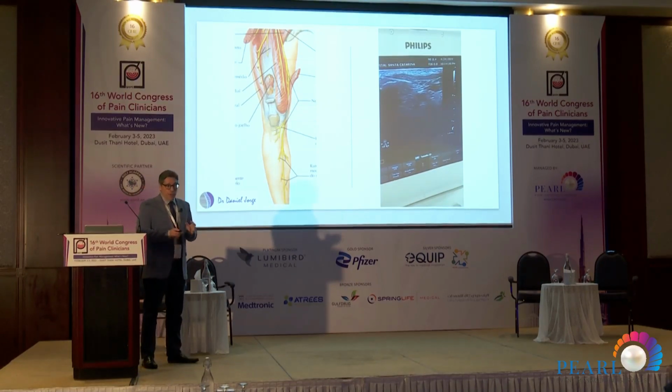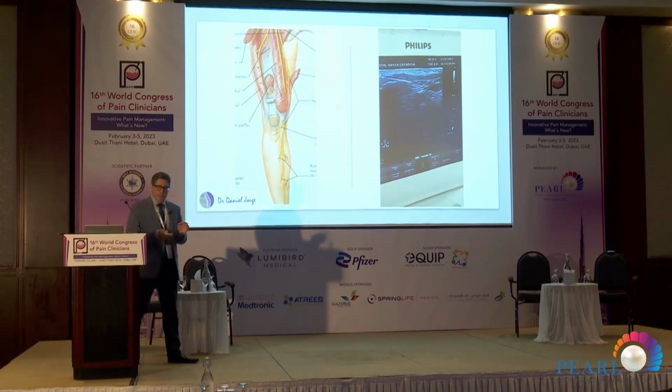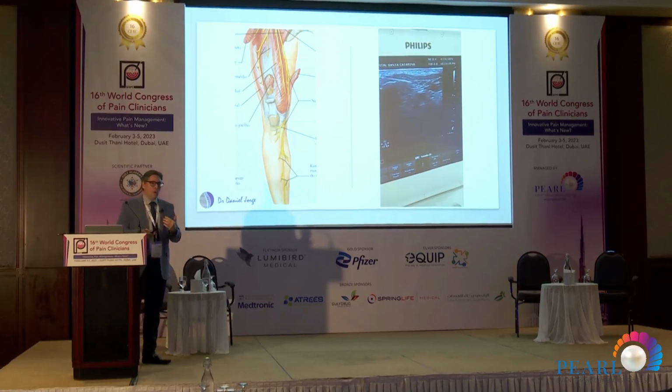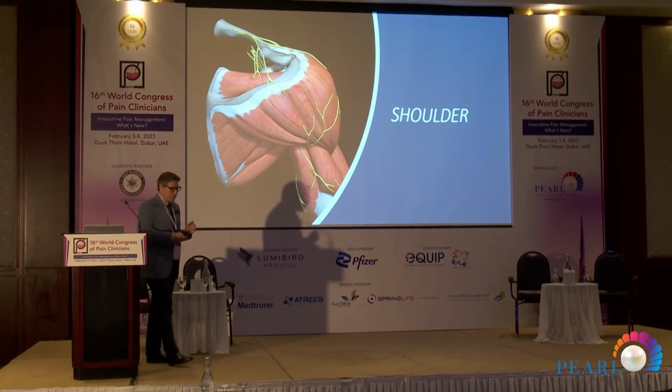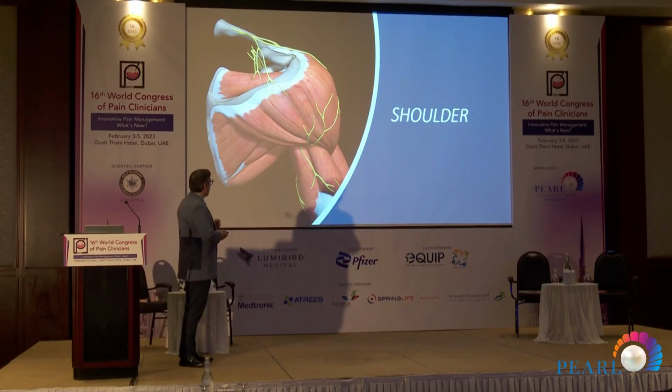And it's great because actually at the end of the procedure you can pull your needle a little bit over and put your hand up and go inside of the joint, and you can medicate or combine with another pulse radiofrequency interarticularly also. For the shoulder, we have some good indications as well.